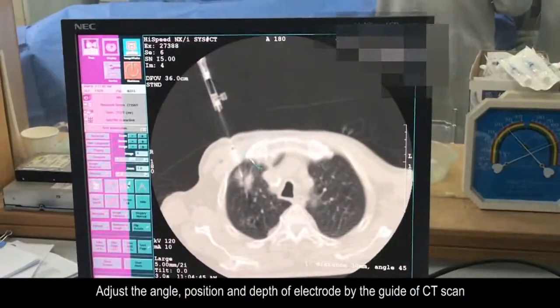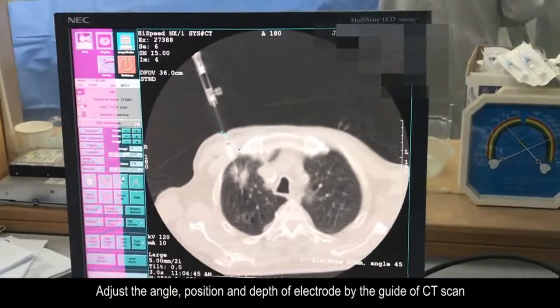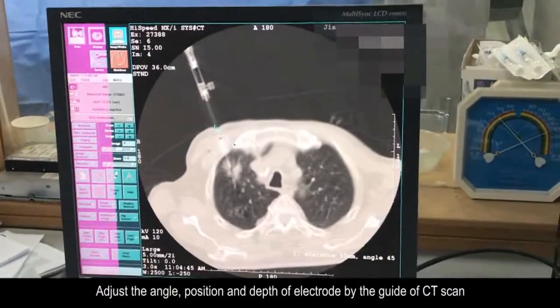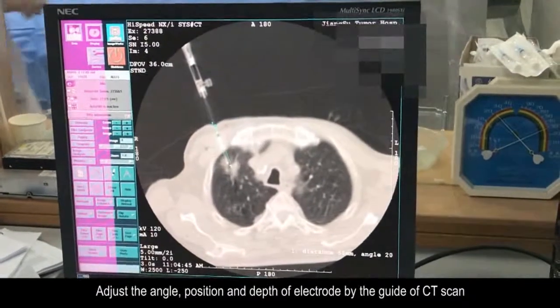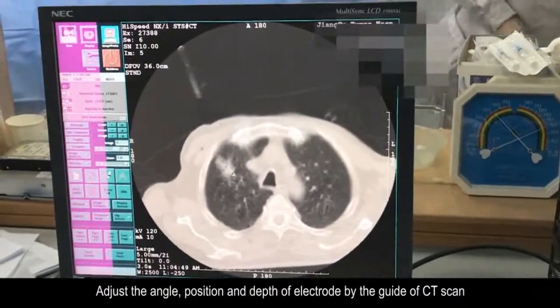Adjust the angle, position, and depth of the electrode using the guidance of the CT scan.